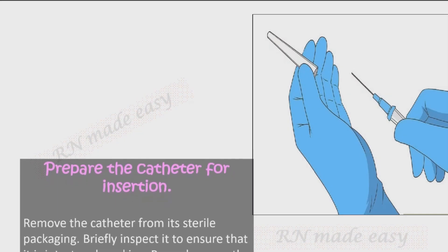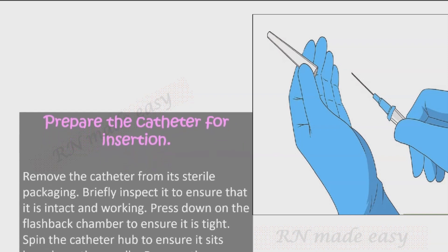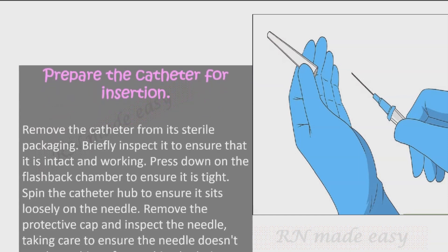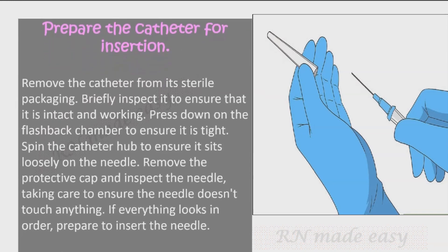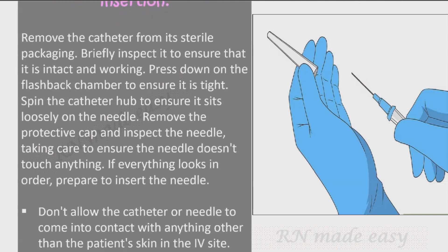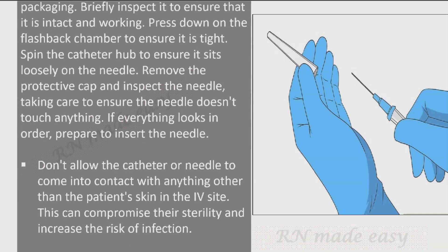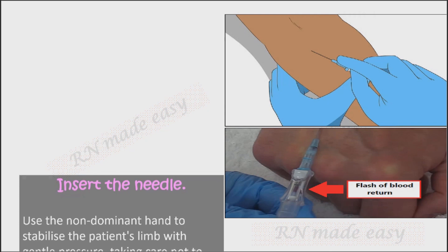Prepare the catheter for insertion. Remove the catheter from its sterile packaging and briefly inspect it to ensure it is intact and working. Press down on the flashback chamber to ensure it is tight, and spin the catheter hub to ensure it sits loosely on the needle. Remove the protective cap and inspect the needle, taking care to ensure the needle doesn't touch anything. Do not allow the catheter or needle to contact anything other than the patient's skin at the IV site, as this can compromise sterility and increase infection risk.